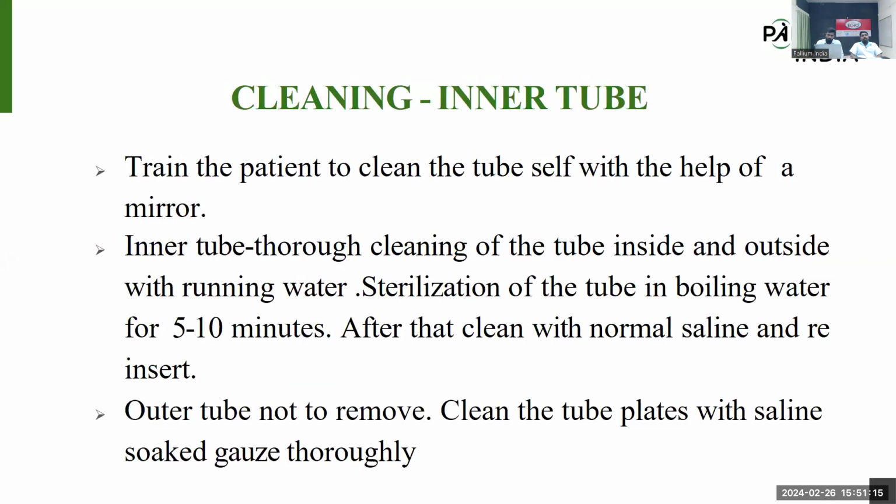Next slide. So for cleaning the inner tube, the patient can do it or the caregiver. We can train the patient to clean the tube by themselves with the help of a mirror. Sitting in front of a mirror, with that support they can remove the inner tube and do thorough cleaning of the inner tube, inside and outside, under running water.